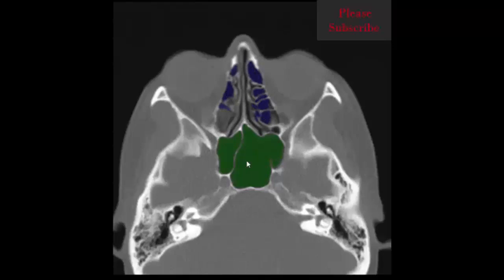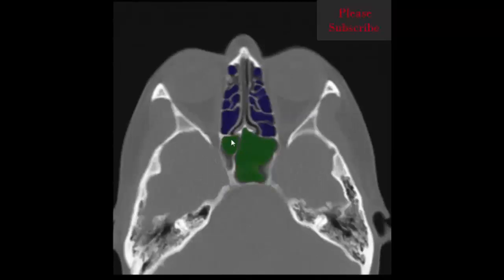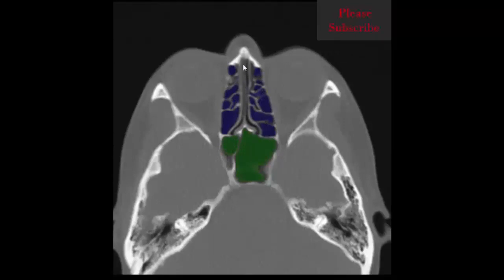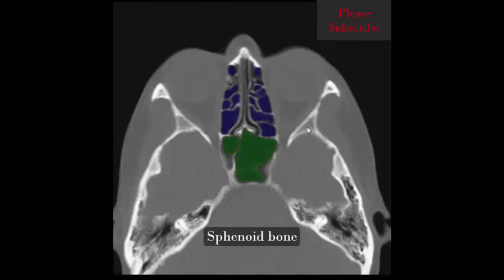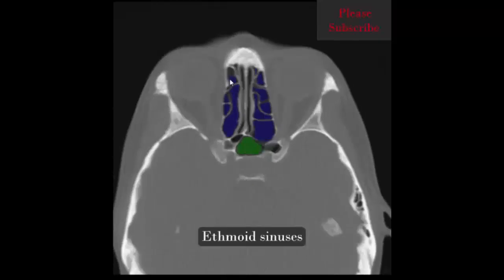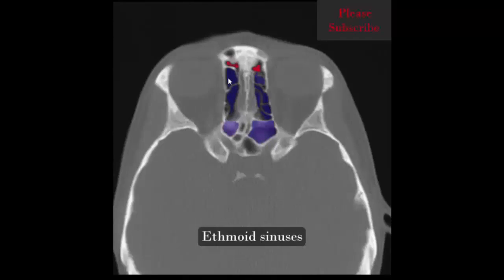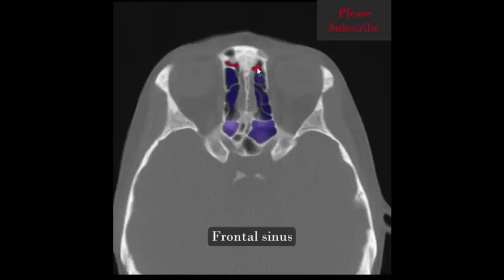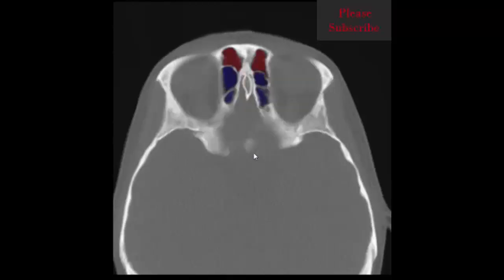Nasal septum, sphenoid sinus, and ethmoid sinuses are clearly seen. Also identified are the nasal septum, nasal bone, right and left zygomatic bone, right and left sphenoid bone, and right and left ethmoid sinus.